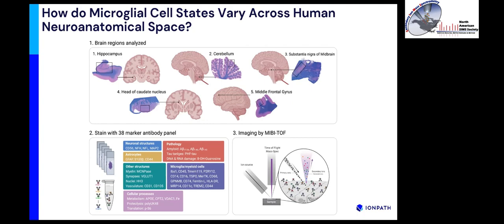Unlike immune cell types, microglial cell functions can't be easily bucketed based on protein expression, like we saw back in the triple negative breast cancer and the DCIS examples, where we use proteins to say positive or negative for a particular cell type, and that tells you something about what that cell's function is. Here, protein expression of microglial cells doesn't explicitly dictate a cell's function. The function of microglial cells ranges from less active to more active, and that function level varies in different regions of the tissue.